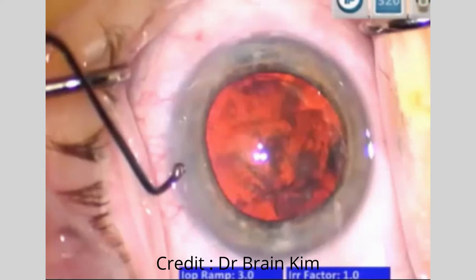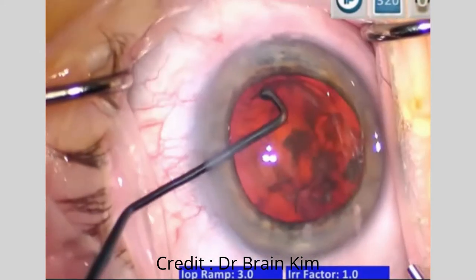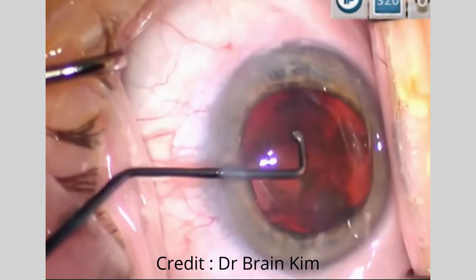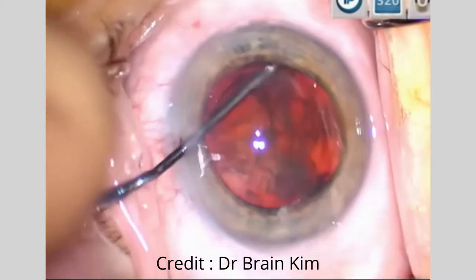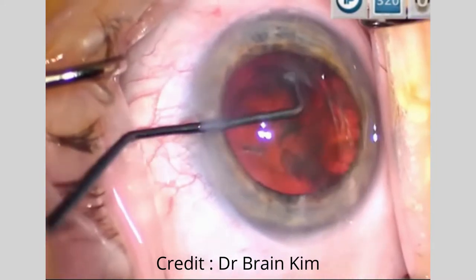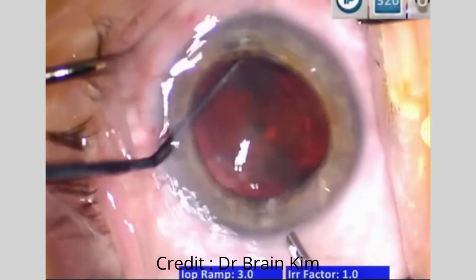Here is another example. I'm in the pronated position going into the eye, sliding under the epinuclear material, rotating my hand. I'm nudging the lens just to prove that I am indeed in the equator, because as I do that maneuver, the lens jiggles. The lens moves within the horizontal plane. If I'm on top of the lens, when I try to supinate my hand, all it does is cause the lens to tiddly-wink, and it doesn't actually move horizontally.